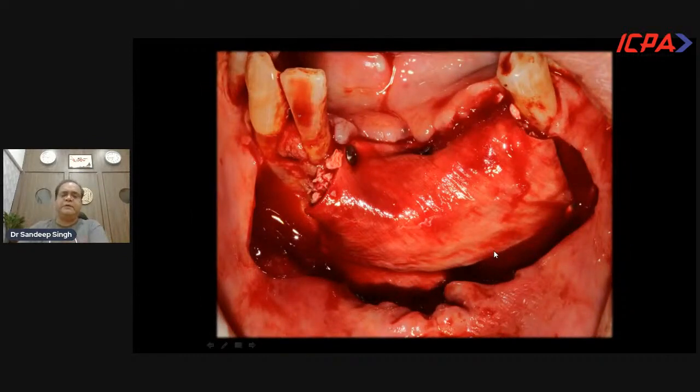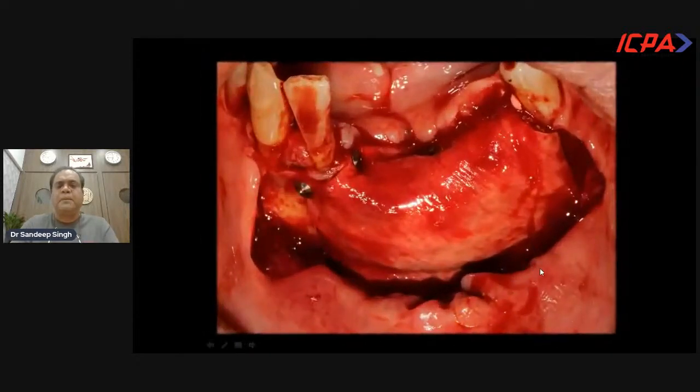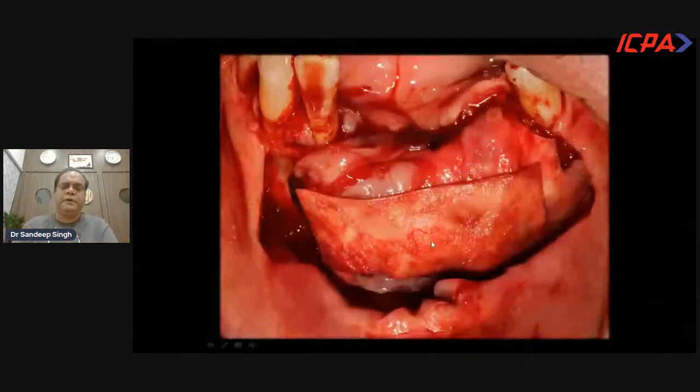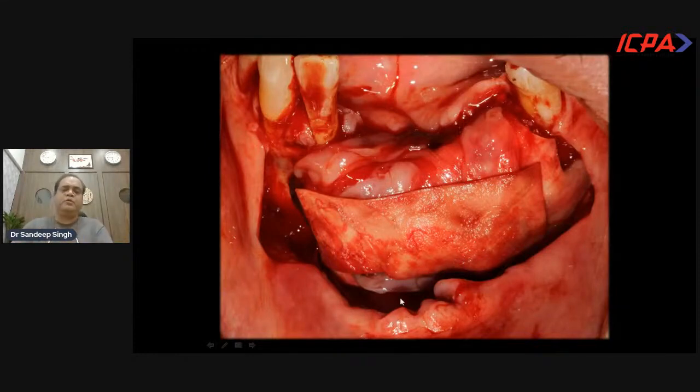And this technique I have learned from Professor Damien Boozer, that I use a larger 30 by 40 membrane, and I take a strip, cut it longitudinally and keep it aside. And then when I finish my GBR procedure, on top, if you can see, I placed another layer of membrane horizontally, making it 2 layers, so that you slow down the resorption of the membrane and give more time to the bone graft material to mature. So it delays the resorption of the membrane.